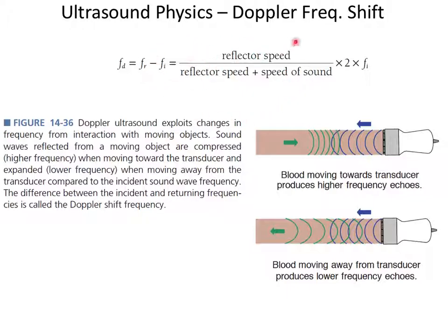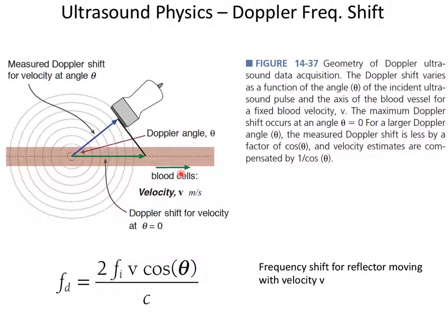and this still works, obviously, because you have, in fact, little ultrasound reflectors in the blood, like blood cells, erythrocytes, and things like that. If you want to reflect a lot of signal from the blood, you can inject tiny little air bubbles, micro bubbles, into the blood, such that they're so small they don't hurt you physiologically, but they are hugely echogenic, right? They make this big reflection of echo.